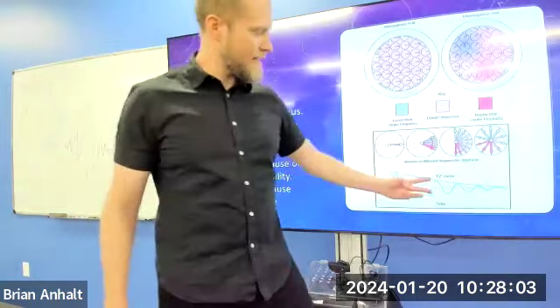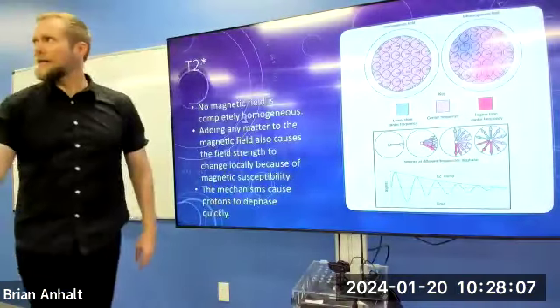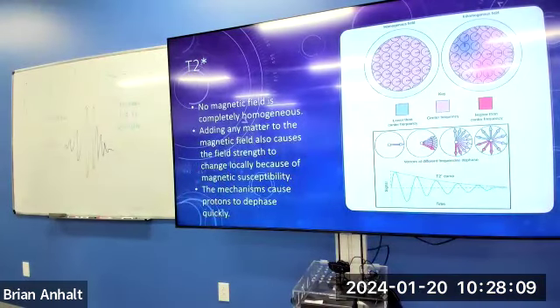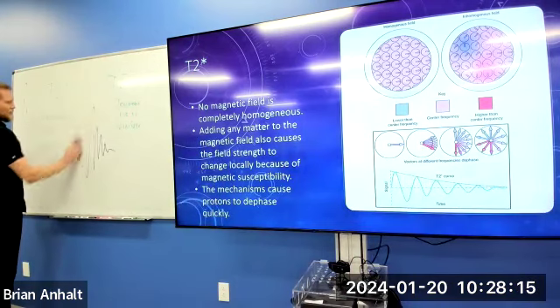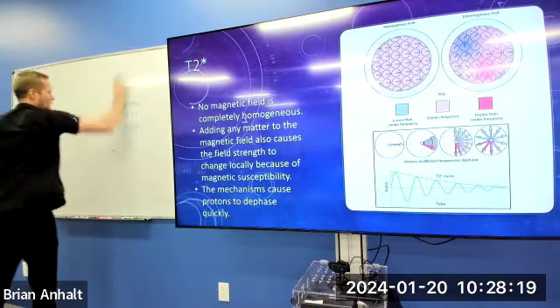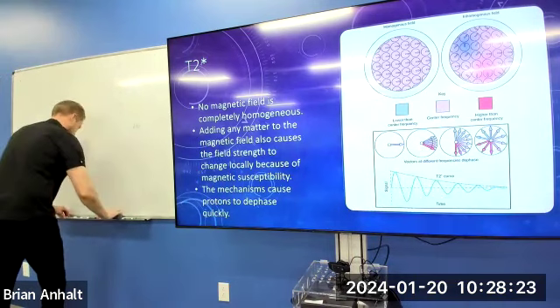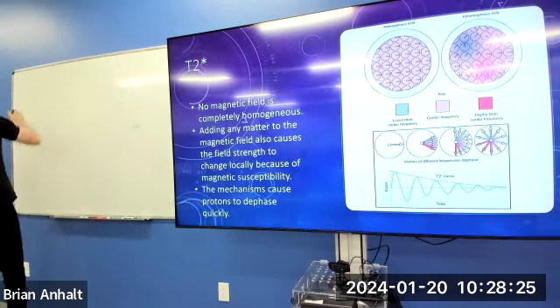We can graph the loss of signal over time, right? So if we did a 90-degree excitation pulse and turned on our receive coil, we would see a lot of signal right off the bat, because we'd have 100% transverse magnetization. So let's say this is the 90-degree RF excitation pulse.